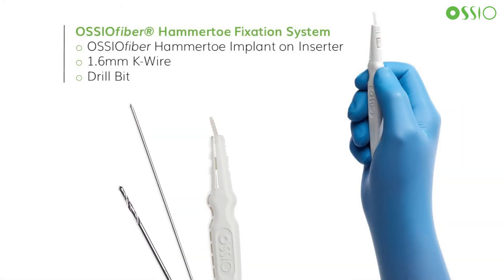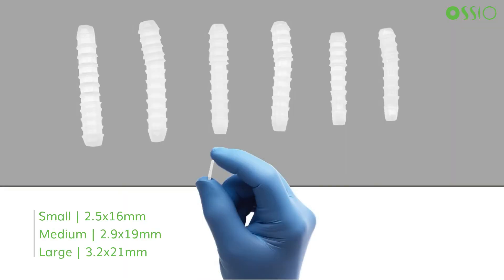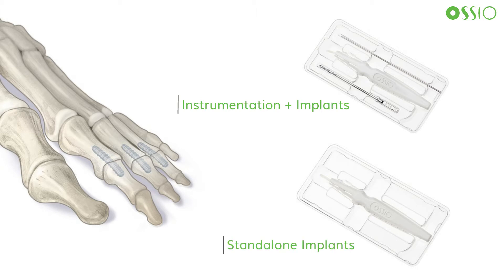Provided in the osseofiber hammer toe fixation system is convenient, sterile, disposable instrumentation, and the osseofiber implant preloaded on the inserter with a 1.6 millimeter k-wire and a drill bit of corresponding size. Hammer toe implants in small, medium, and large sizes in zero degree straight and 10 degree angled are offered to accommodate a wide range of patient anatomy. The kits are offered with the instrumentation included or standalone implants to facilitate cost savings for facilities when treating more than one hammer toe per patient.